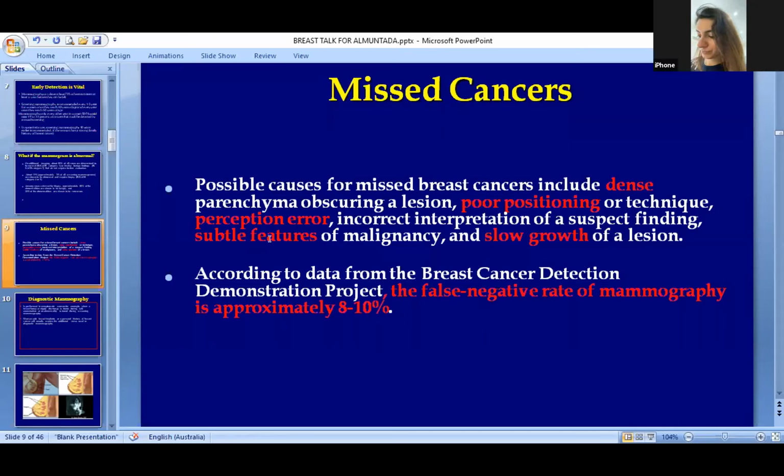Sometimes the cancer is very subtle. It's really hard to say. Even only in retrospect can you say, oh, here you go, that's where it is. But even if you look harder, with breast screening, the radiologists usually check the images. And sometimes the lesion is very slow growing, so we do follow up.